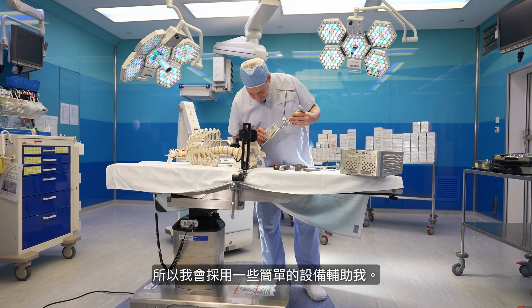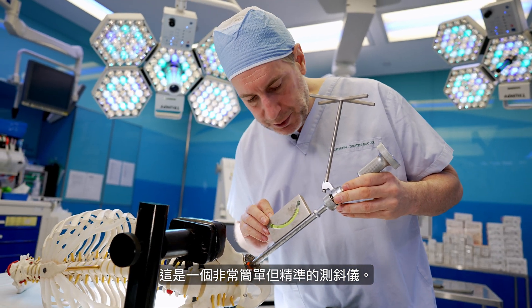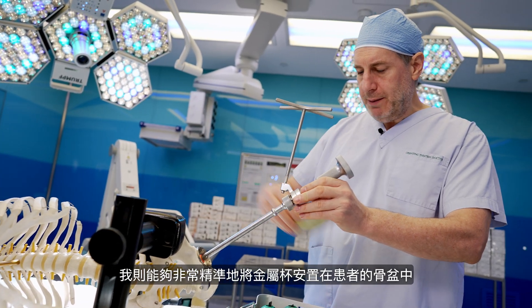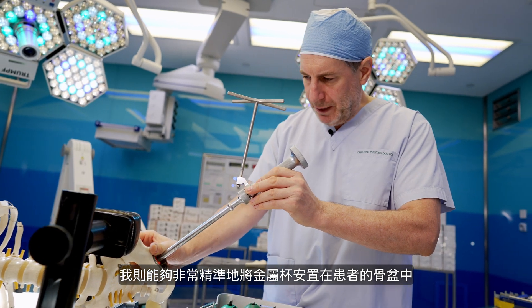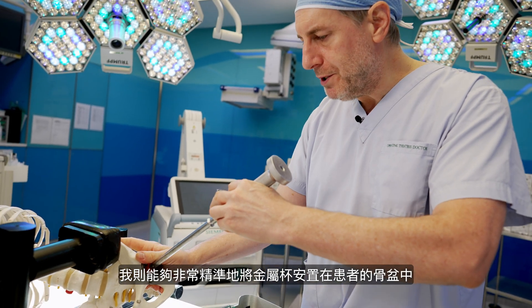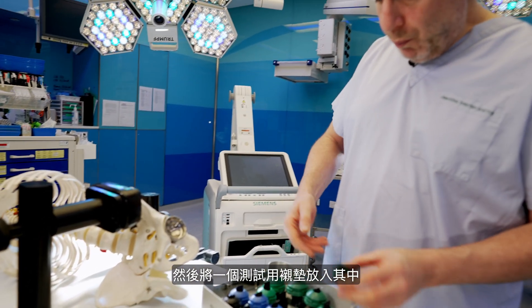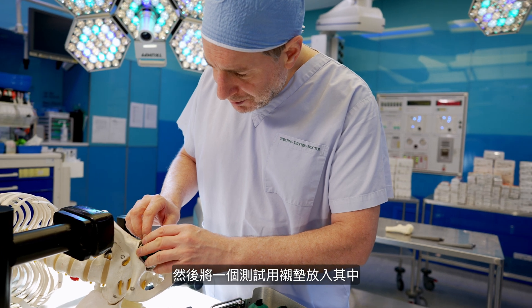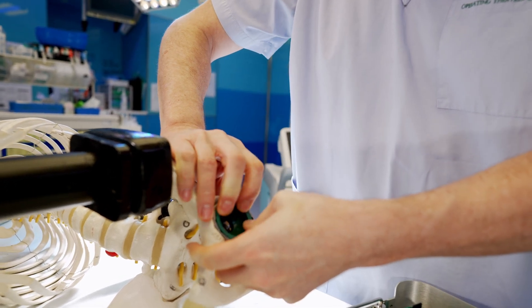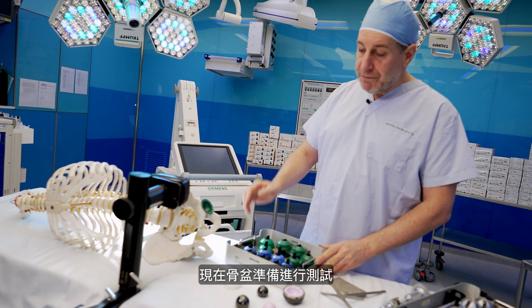There's a 54 mm definitive cup, and we need to position that exactly in the correct anatomical position. I have some simple devices to help me with this: an aerial and a very simple but accurate inclinometer, which is a form of spirit level. So I'm able to position that metal cup in the patient's pelvis very precisely, and then I can put one of my trial liners into it. And that's the pelvic side ready for testing.